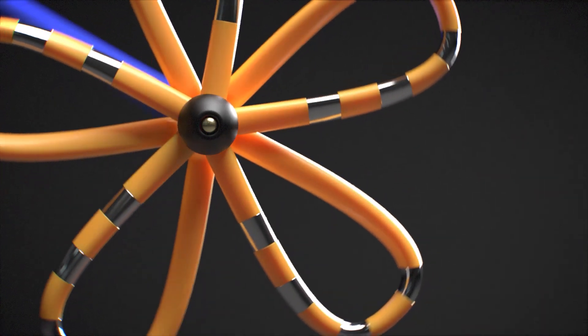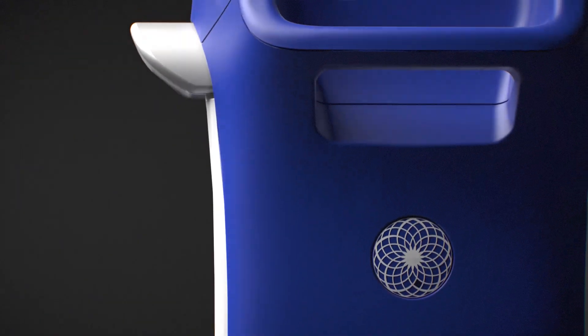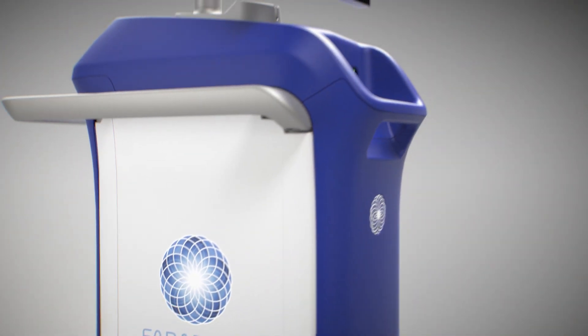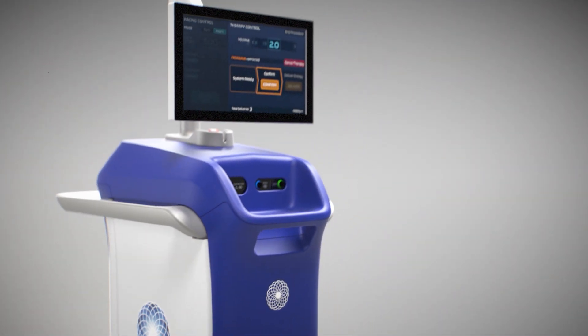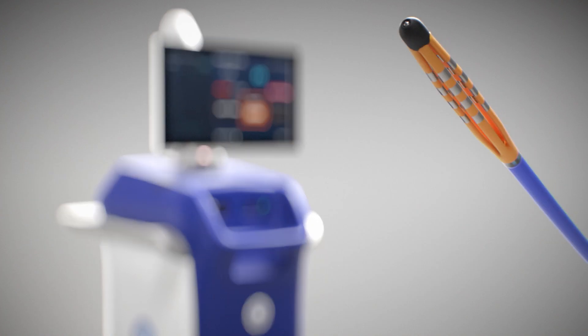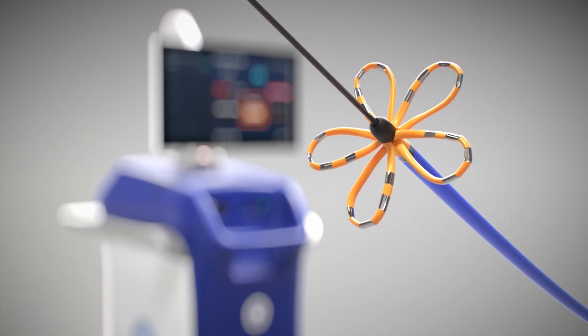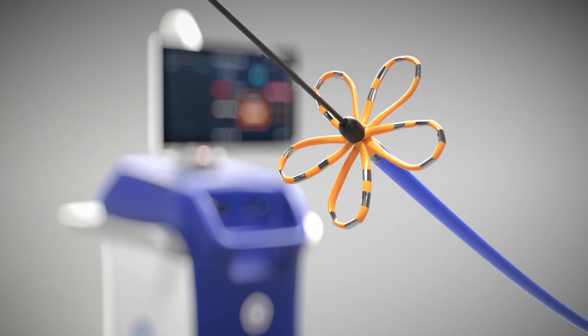The Farapulse Pulsed Field Ablation System by Boston Scientific offers a non-thermal and tissue-selective approach to cardiac ablation and treatment of paroxysmal atrial fibrillation by addressing traditional thermal ablation limitations, which can include inadvertently damaging collateral tissues.